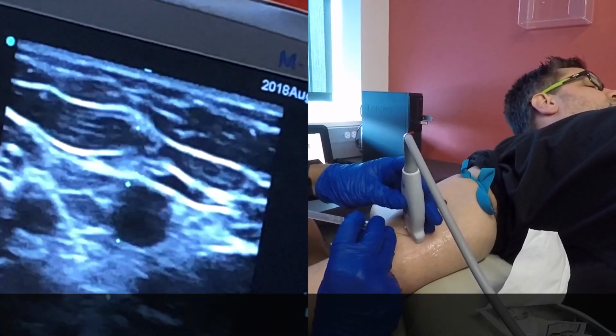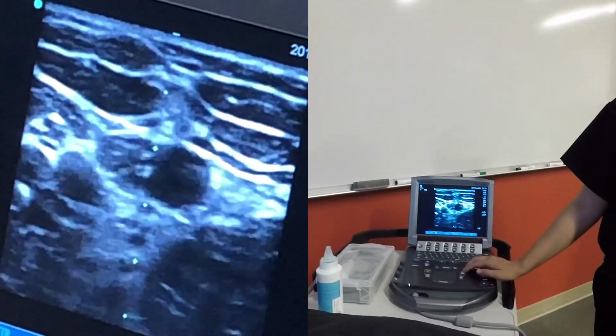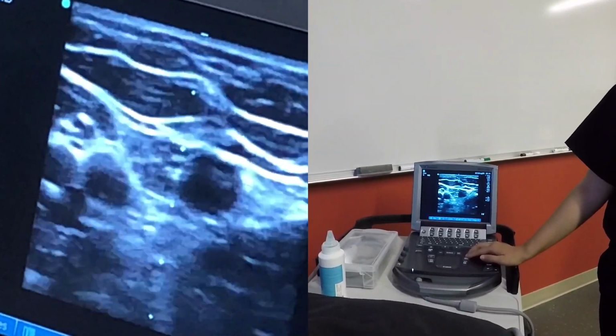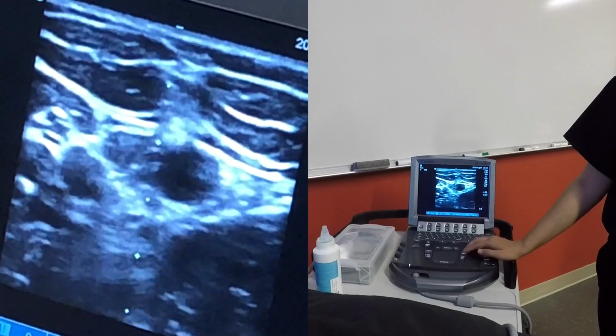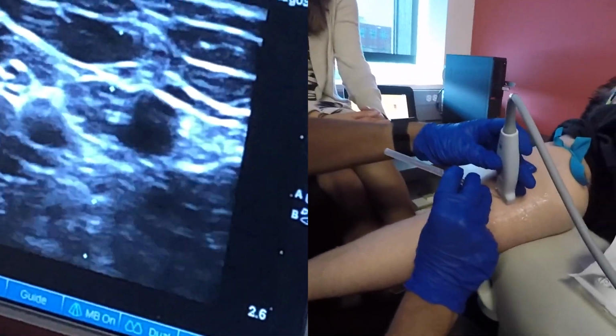There you go. So if you're not sure where the needle is, try bouncing it, and then you get an idea of where the needle tip is just based on the tissue deflection, even if you can't see the needle tip. Which way should you bounce? Vertically. Is that particularly painful? You're doing okay? It's okay.